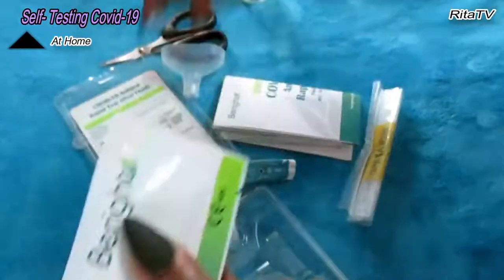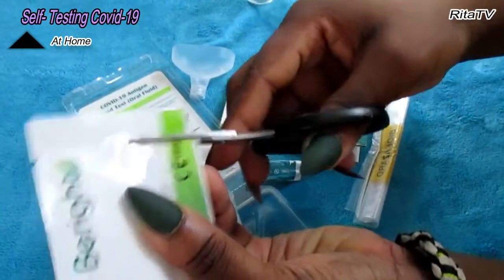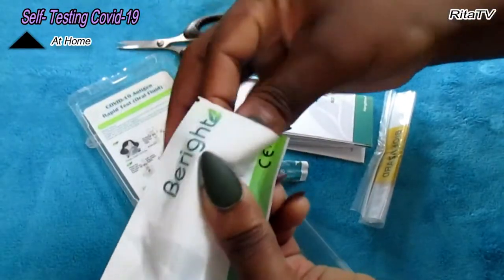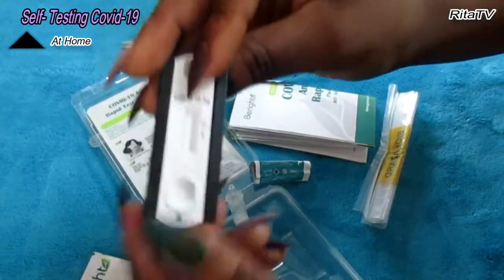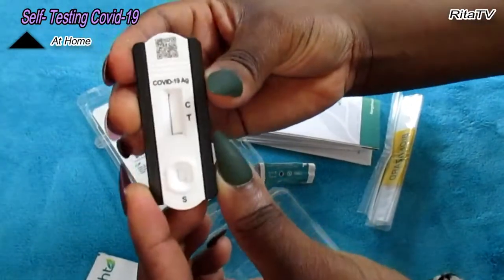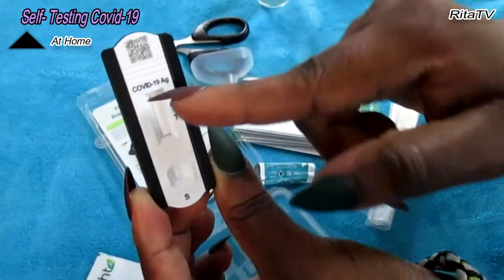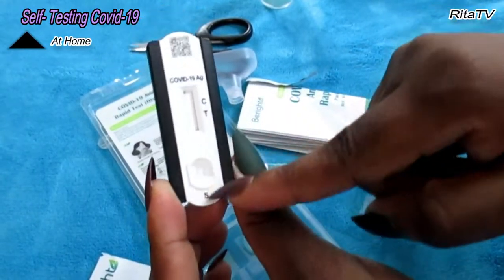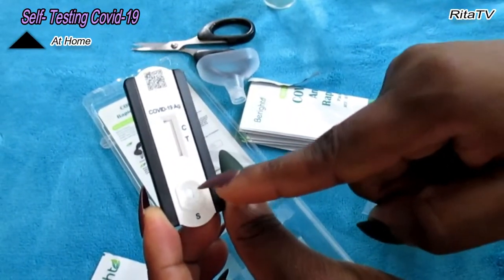So now we're going to open this. You can use your scissors, you can also use your hands to open. So now here's the test. It has COVID-19 AG on it. So this is where we are going to drop the fluid inside.